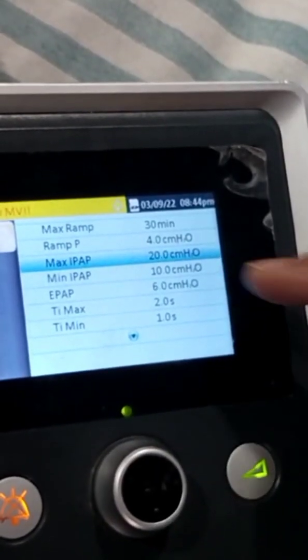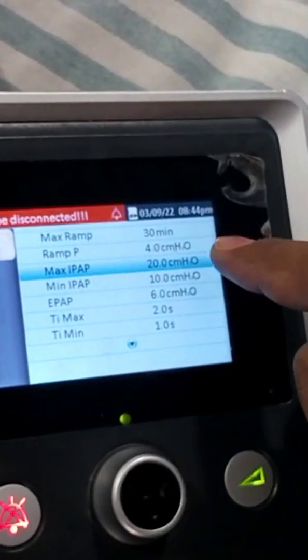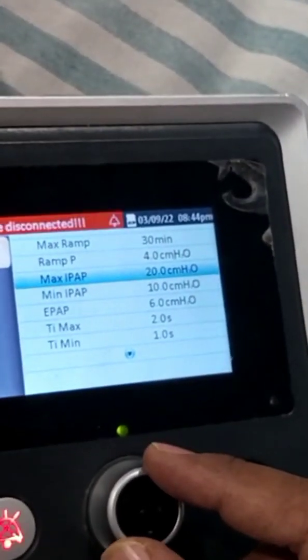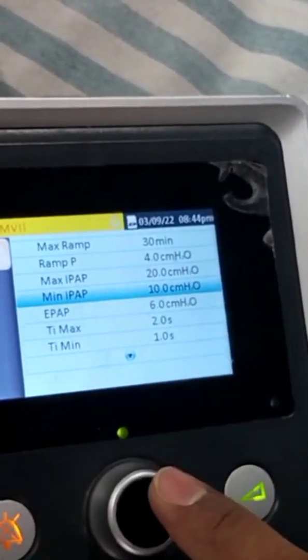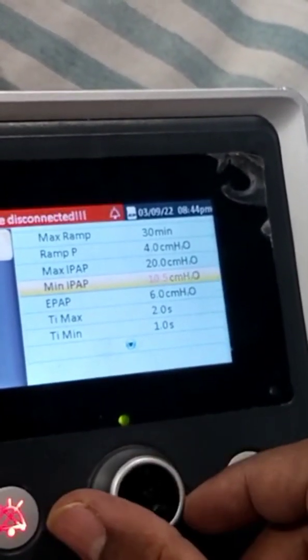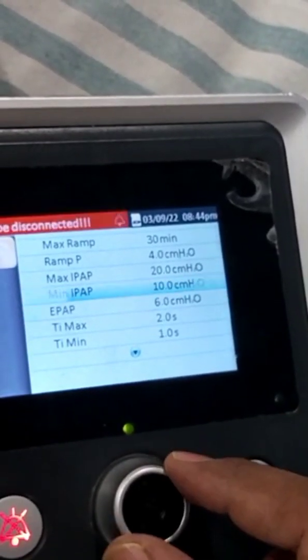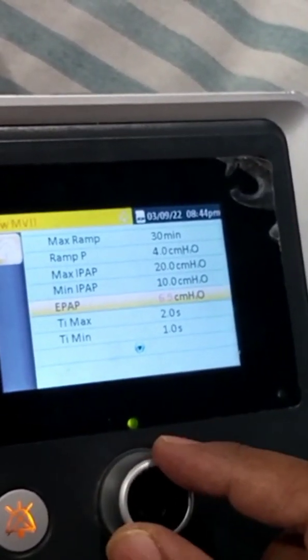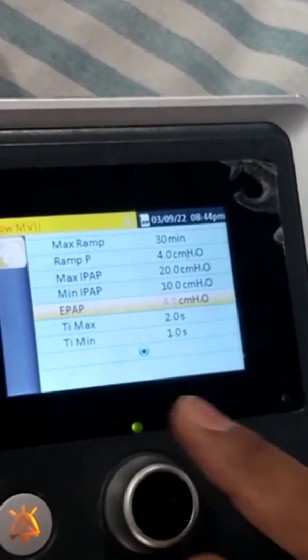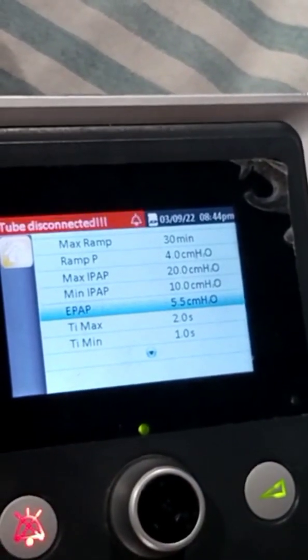The next option is to press and scroll — the same thing to increase or decrease. This is the E-PAP path. Here are the minimum settings.